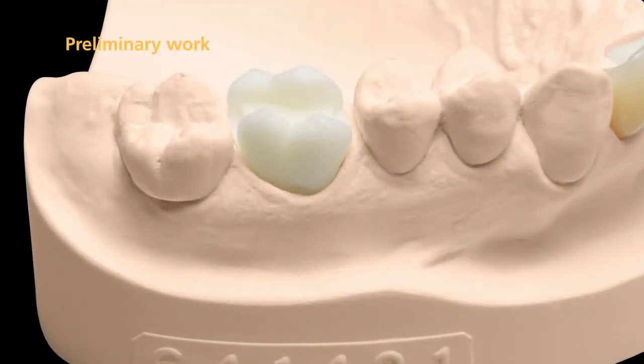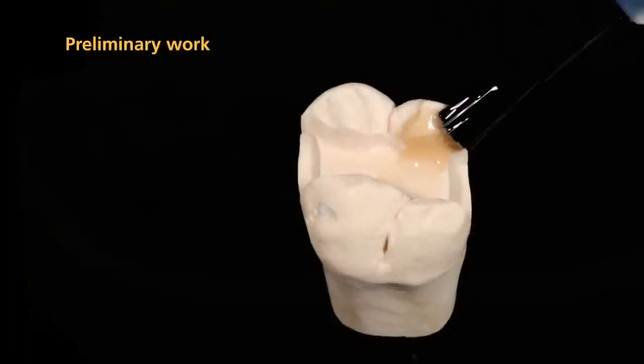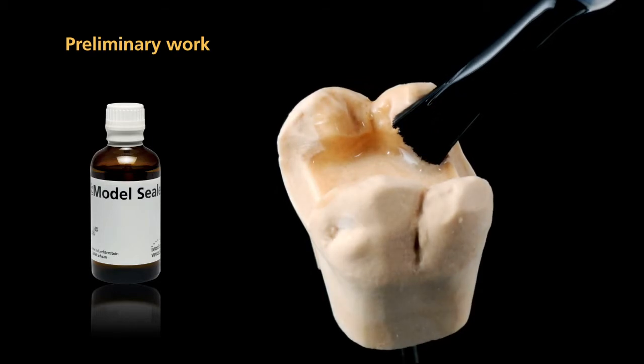First, fabricate a working model with a detachable die as a working basis. It is recommended that you apply model sealer to treat the surface and protect the die.